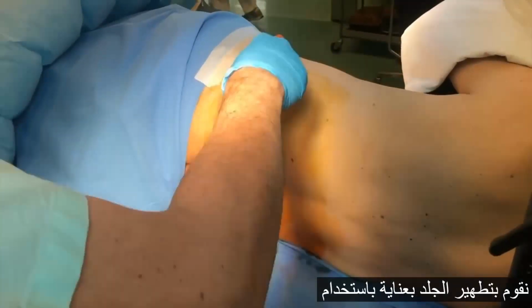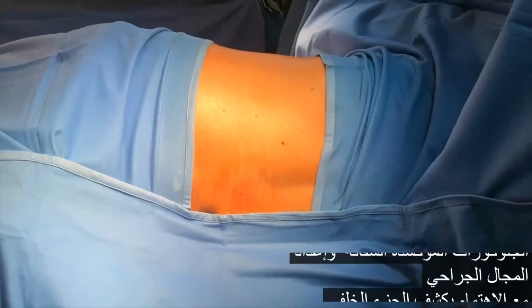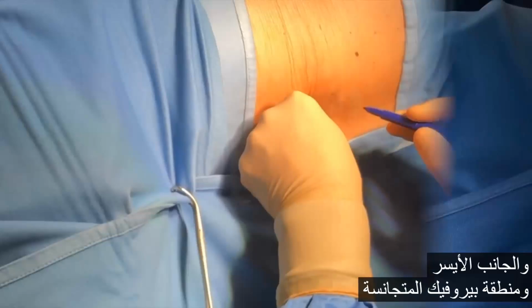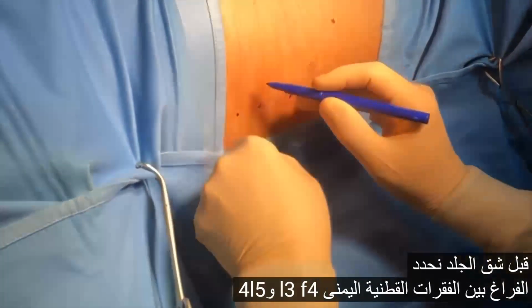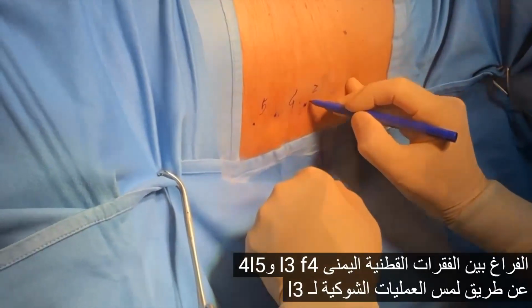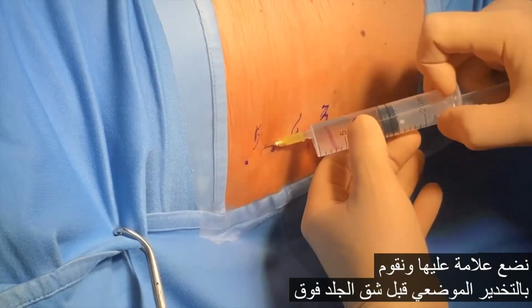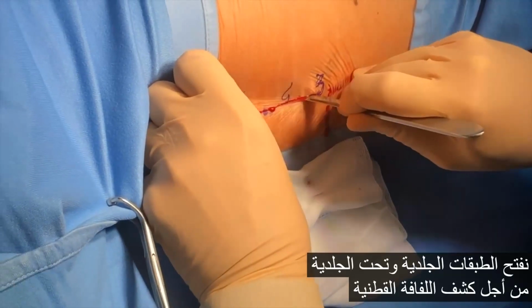We carefully disinfect the skin with the chlorhexidine gluconate and prepare the surgical field, paying attention to leave uncovered the back, the left side, and the homolateral paraumbilical region. Before the skin incision, we identify the right interlaminar L3, L4 and L4, L5 space by touching the spinous processes of L3, L4, L5. We mark them and we perform local anesthesia before skin incision over the midline. We open the cutaneous and subcutaneous layers in order to expose the lumbar fascia.